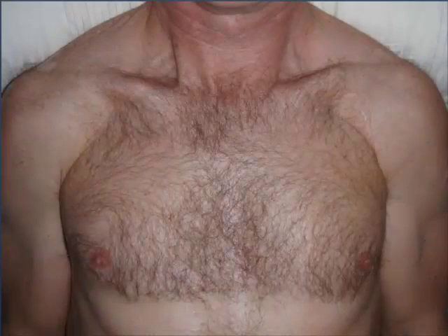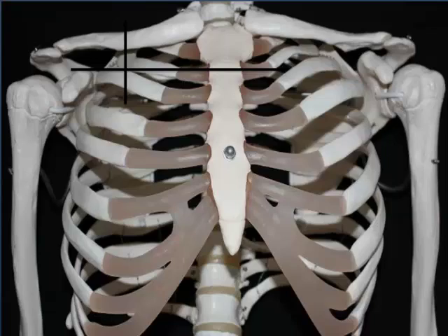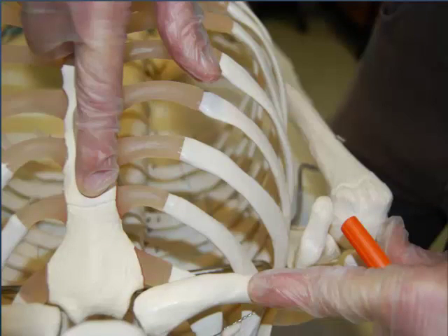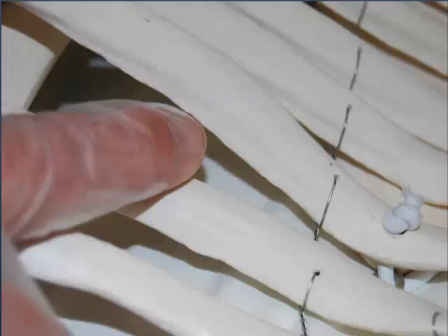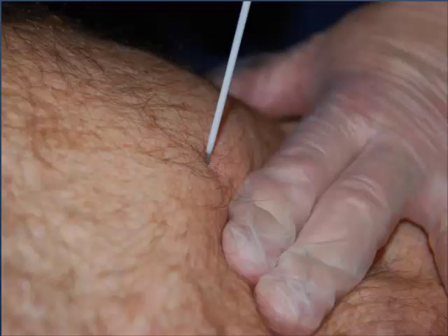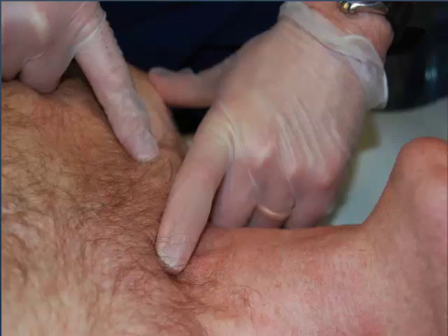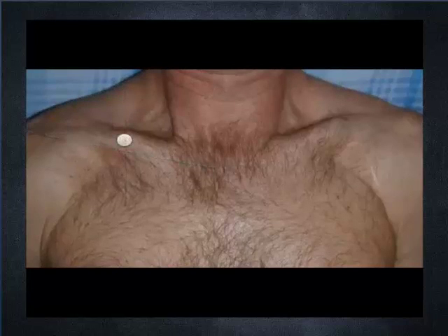But you can't rely on any one of these signs. First way: find the second intercostal space at the midclavicular line. That's traditionally horizontally across from the angle of Louis, or the sternal-manubrial junction, in the midclavicular line. Go above the rib below, because on the deep inferior aspect of the ribs lies the vascular bundle. The quick way to find that place is anteriorly by placing two fingers under the midclavicular point — below that is the second space.